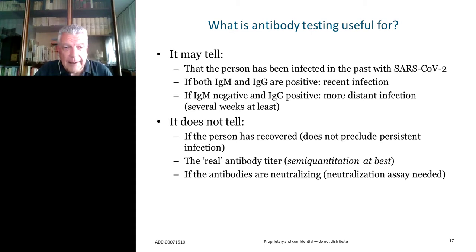And at the same time, as we have seen before, we have binding antibody assays. We cannot tell right away, with any kind of serology you have available now, if the antibodies are really neutralizing. You need a specific neutralization assay to be performed. We may anticipate that this will not last for a long time. Eventually, we will also have assays that will detect specifically the neutralizing antibodies, but not now.